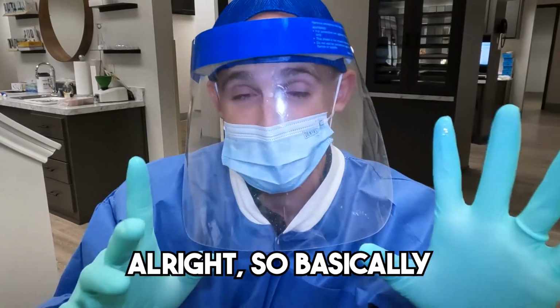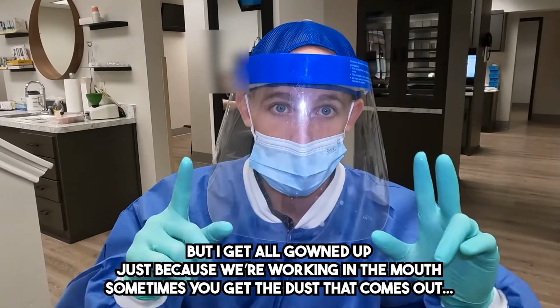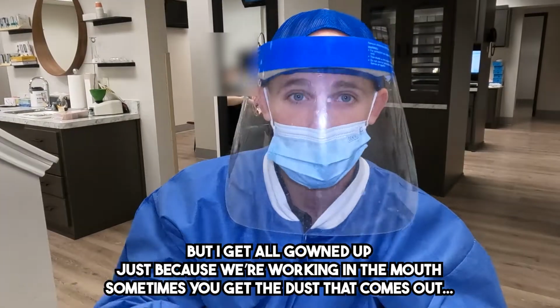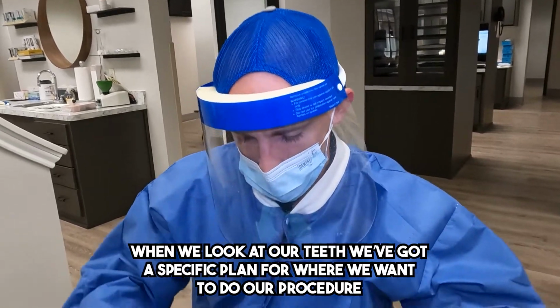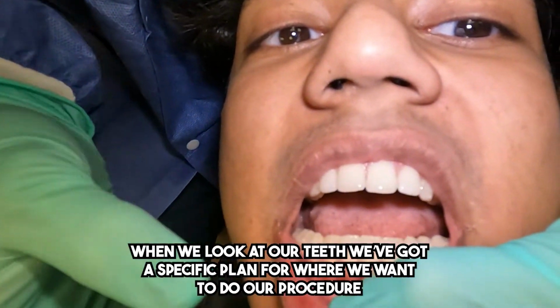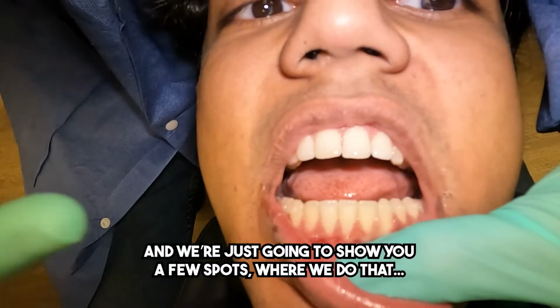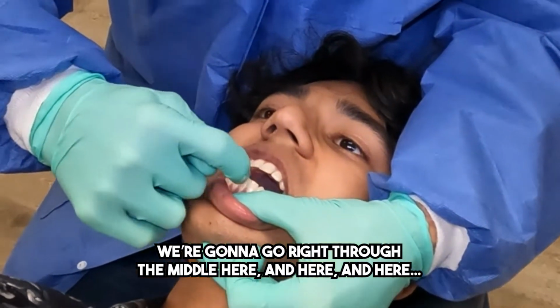All right, so basically, I'm all gowned up now. Not every orthodontist does it this way, but I get all gowned up just because we're working in the mouth. Sometimes you get the dust that comes out, and I'm all gowned up for that reason. Okay, so when we look at our teeth, we've got a specific plan for where we want to do our procedure. And we're just going to show you a few spots where we do that. We're going to go right through the middle here and here and here.